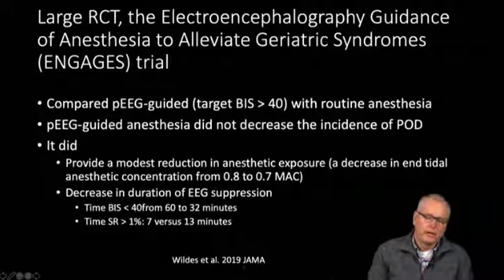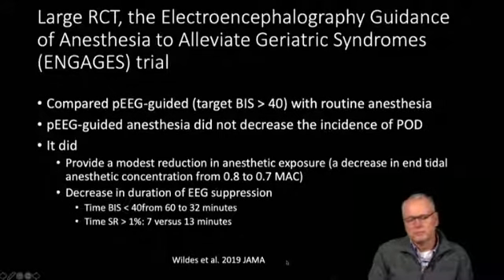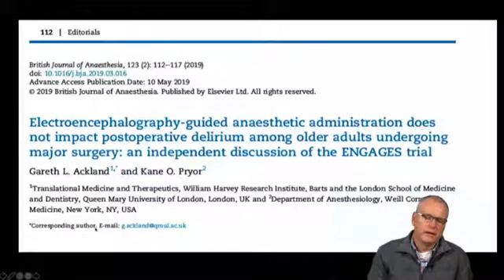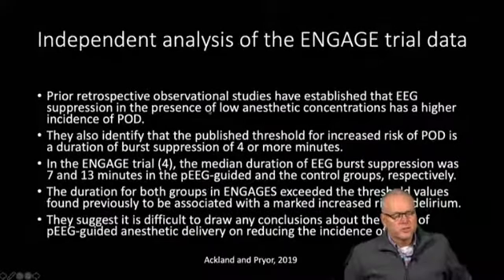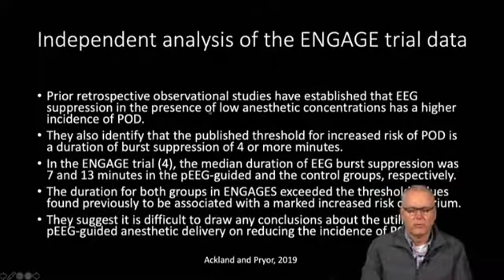And this came out a couple of years ago and caused quite a stir, especially for people who were very pro processed EEG-guided anesthetics. And in fact, a group published an independent discussion of the data reported in the ENGAGES trial. This is prepared by Ackland and Pryor, and in this interpretation of the analysis, they make the following points.